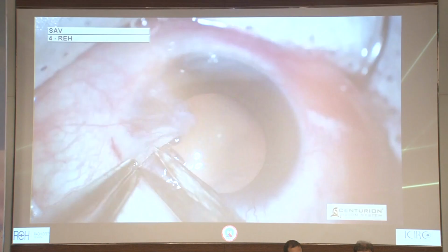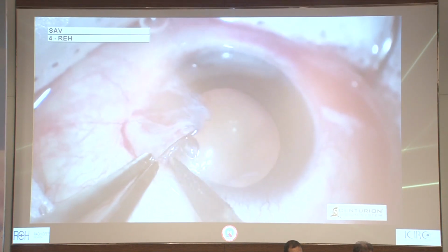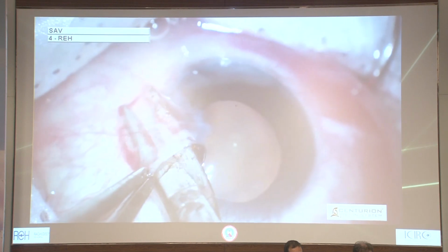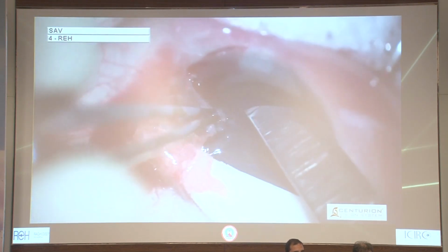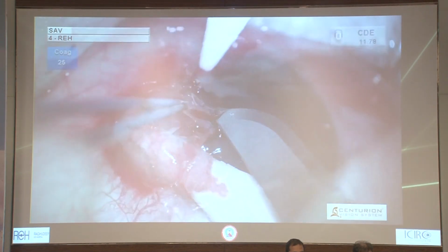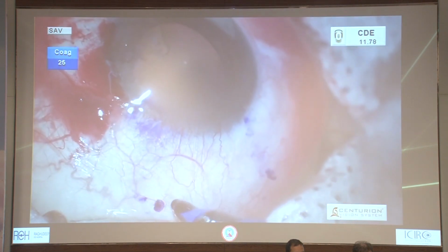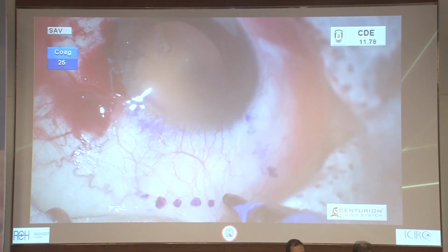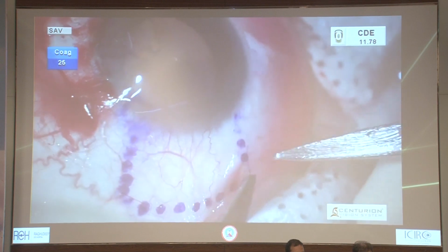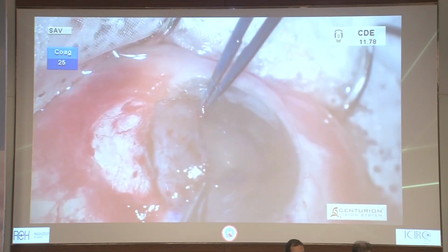And these are the cases where you advise a pterygium surgery first. Such a large pterygium is going to cause higher order aberrations, and high astigmatism. So do a staged procedure, and we always do a pterygium surgery with a conjunctival autograft. A method that I have learned from Dr. Fogla himself: do these markings and see that you get only the thin conjunctiva and no Tenon's along with it.